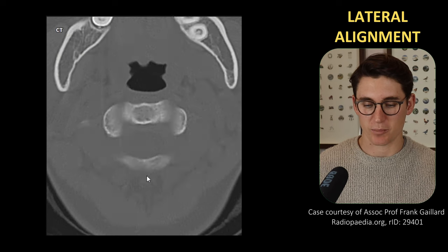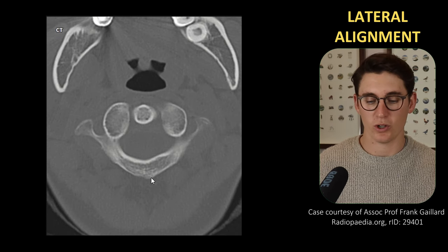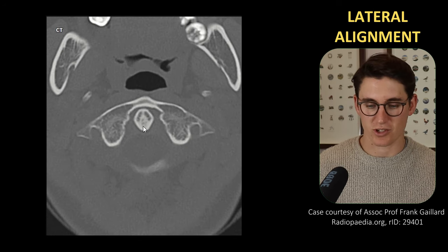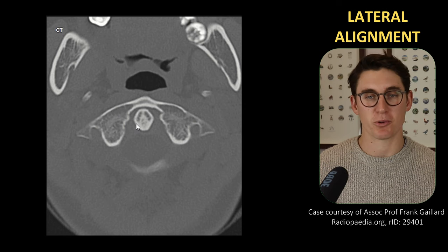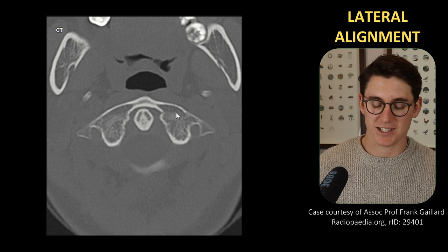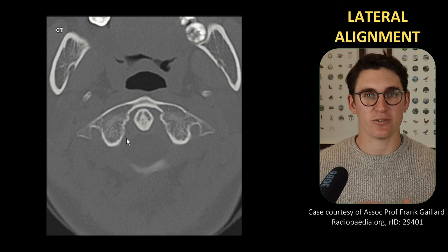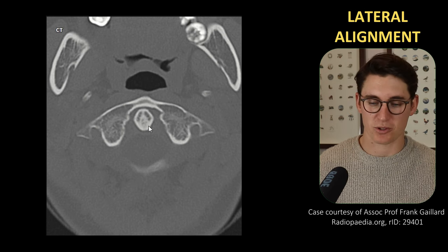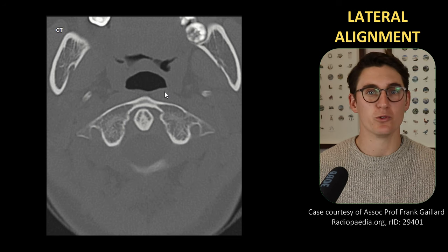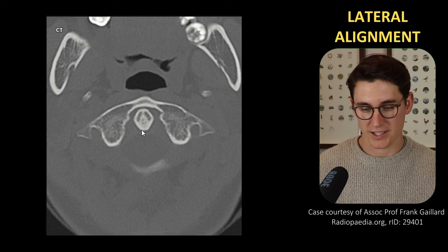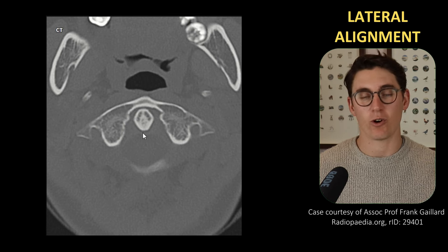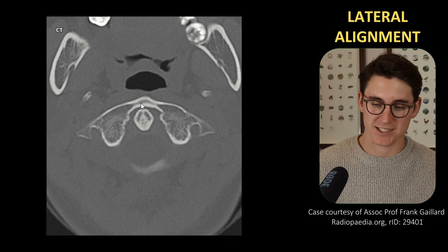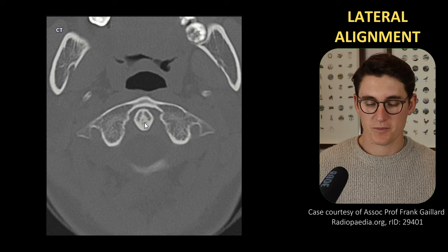We have the posterior arch with a posterior body and sometimes a very small or rudimentary spinous process. You can see the anterior arch is surrounding our dens or odontoid process of C2 sitting below it. Our C1, or atlas, doesn't actually have a vertebral body — this is kind of a remnant of that vertebral body — with C2 contributing this dens process, allowing for rotation, flexion, and movement. There's a transverse ligament that comes across here that holds the dens in place, and an articular surface allows articulation between the anterior body of C1 and the dens process.